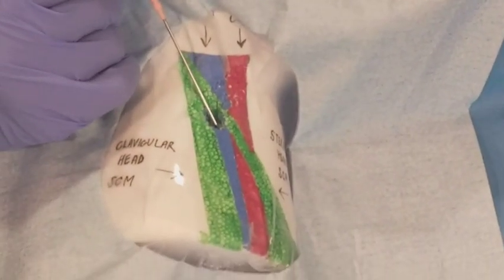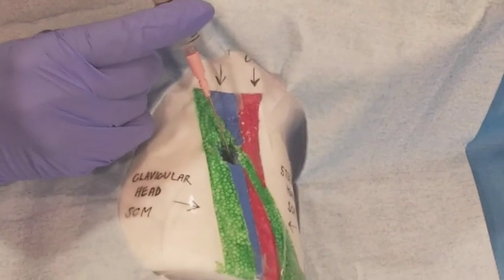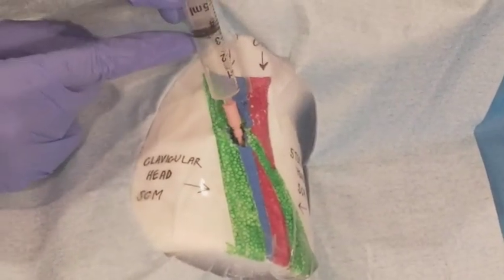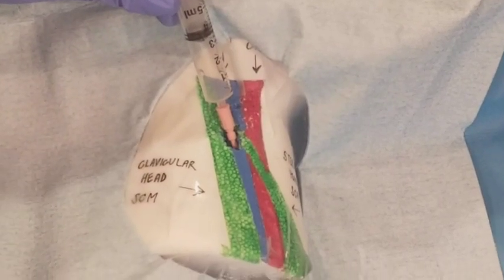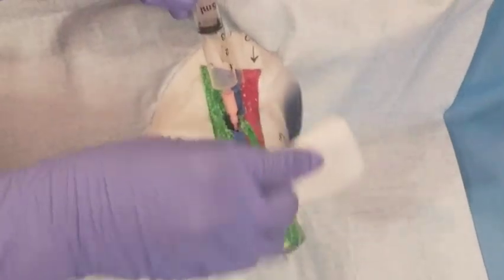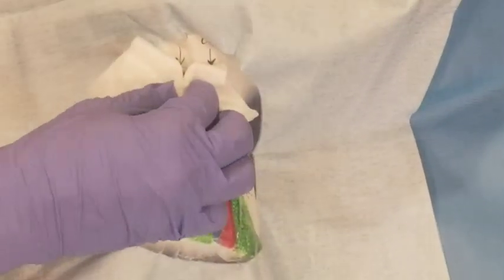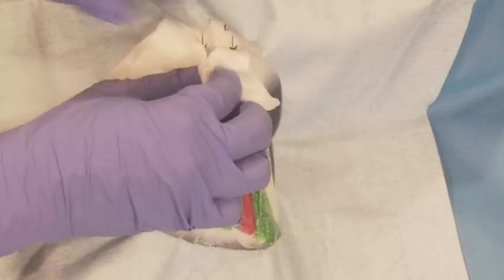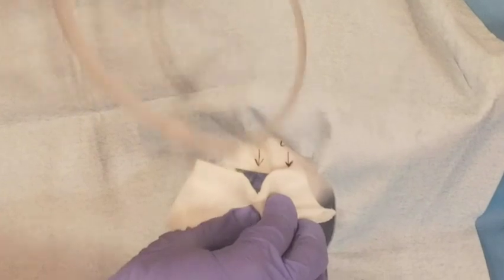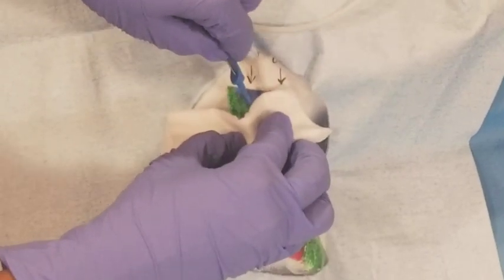So at this point, we've identified our vein and we are aspirating as we go into the vein. Okay, we're going to pretend like we have continuous flashback. What I want to do is just take a piece of gauze and hold it over the hub of the needle to prevent any kind of air embolism while we remove the syringe. Now we're going to introduce our J-wire tip into the needle hub.